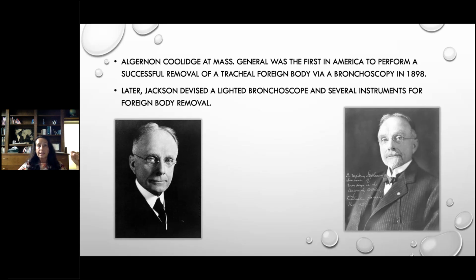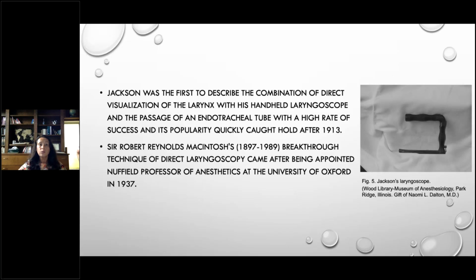And later, in the early 1900s, Chevalier Jackson developed the tool even further. He devised a lighted laryngoscope and bronchoscope and several instruments for the removal of foreign bodies. Jackson was the first one to describe the combination of not only visualizing the larynx, but also passing the endotracheal tube into the larynx.